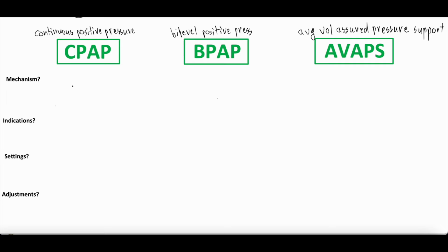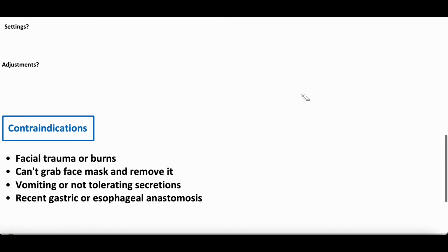So you set the pressure, and we'll talk about settings down here, but you set a continuous constant pressure that the lungs are always feeling. And what that means, if you think about it, so I'll erase this in a sec. Actually, maybe I'll draw it lower and we can keep it up so we can reference it again. So essentially, I'll draw a line here.